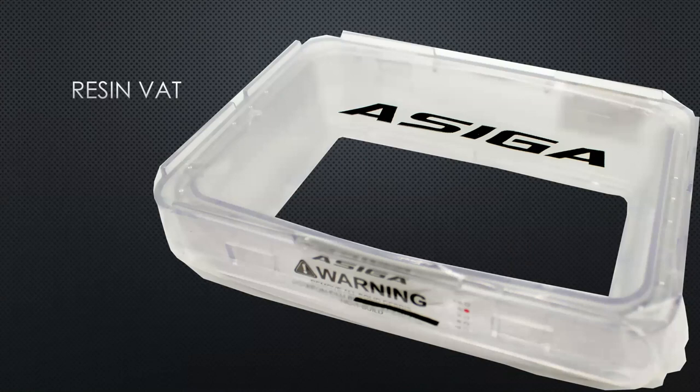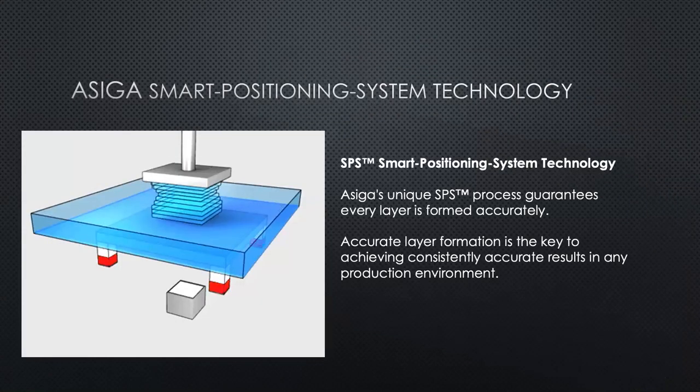Some printers, like Asiga, have built-in sensors that will track how many builds and how much resin volume has been processed by your resin tray, and will automatically notify you that it's time to replace your resin tray soon. You can typically choose to ignore this, but be forewarned that if it does fail, you can have resin leak all over your optical window, or even worse, cause damage to your actual light source or other internal printer components. I've also included an animation that demonstrates the peeling process that we just described.